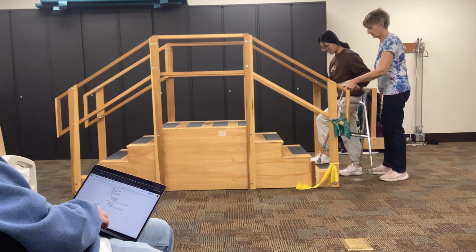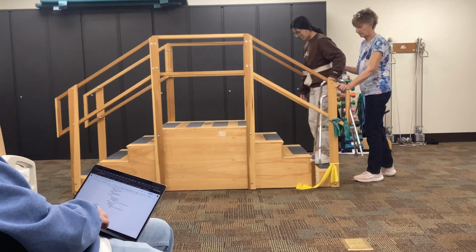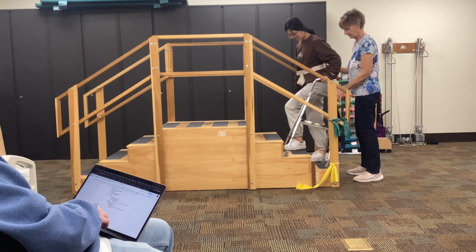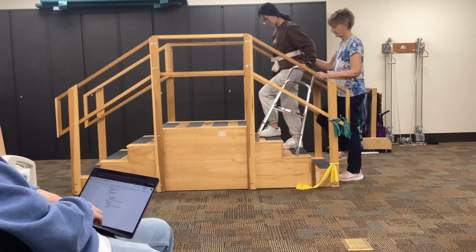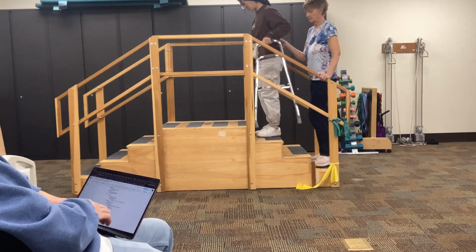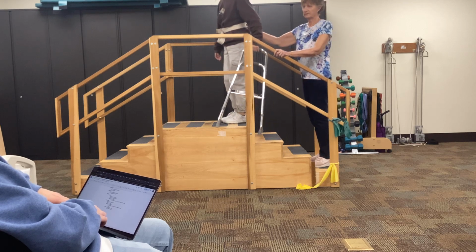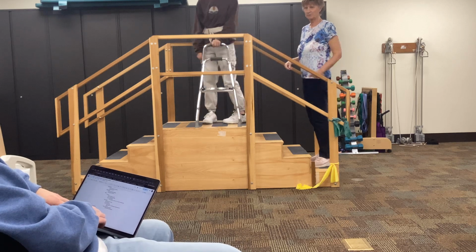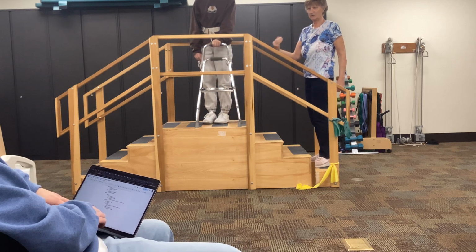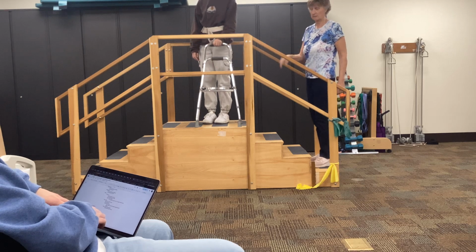So actually, this would be like a walker, would be up on the step first. Then bring it up to the next step. There you go. Does it look, oh, good. Does it look real safe there? She put a little extra pressure coming up. Did you see how it tipped forward, or tipped backward actually, a little bit? The 2 front feet came off.